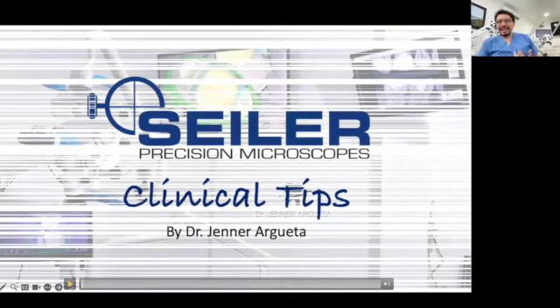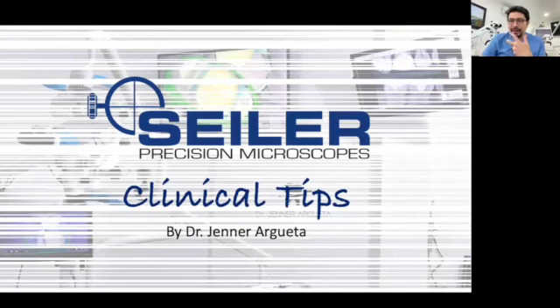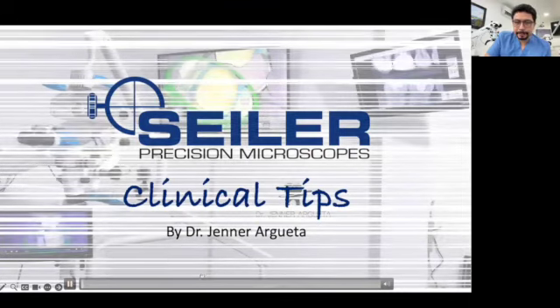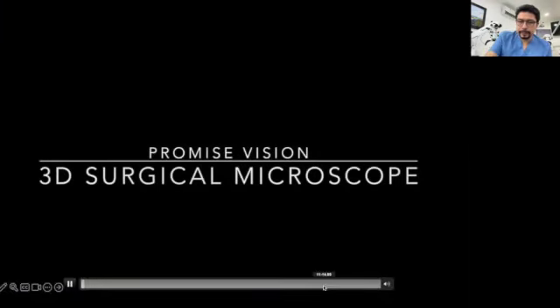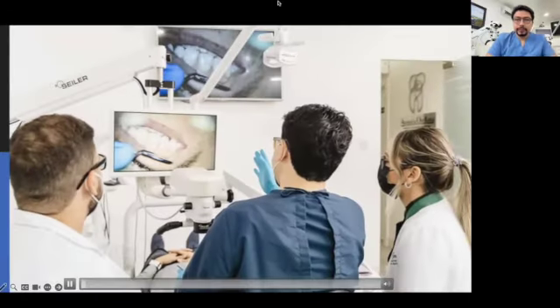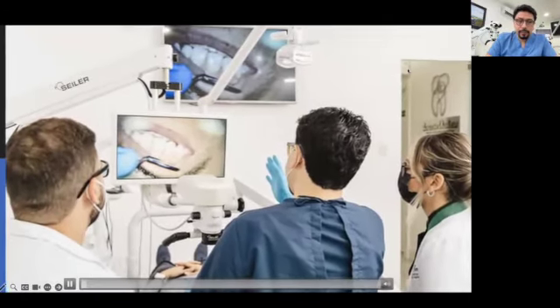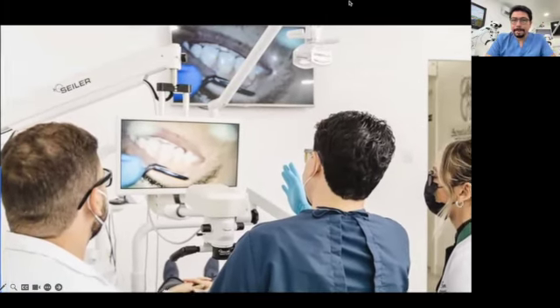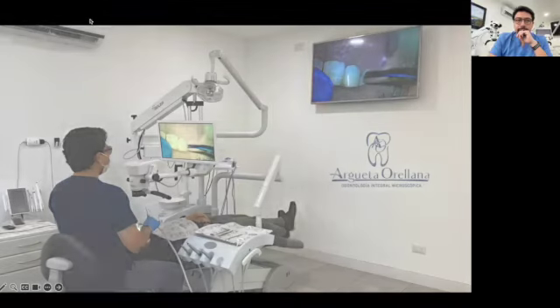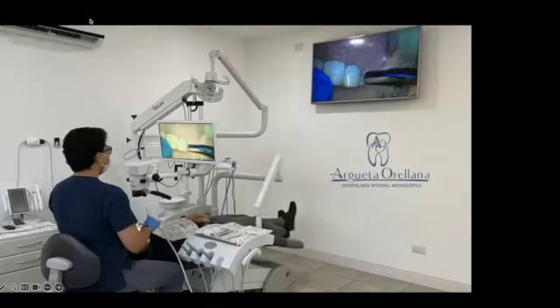So this video is like a resume of what we have been talking about. The Promise Vision 3D surgical microscope is an excellent tool that will enhance the clinical abilities of the clinician. In this video, I will show you the most important factors to have into consideration for having the most comfortable clinical experience.